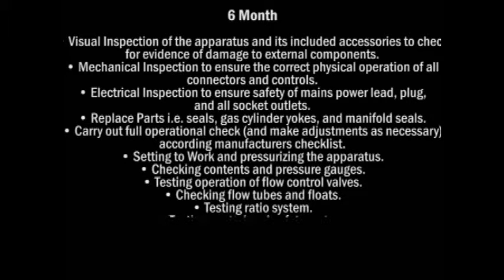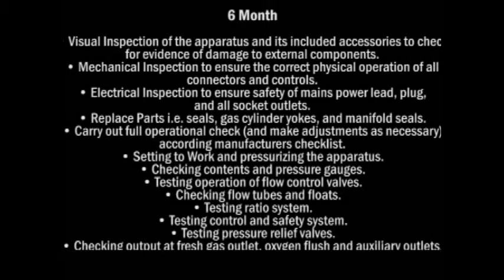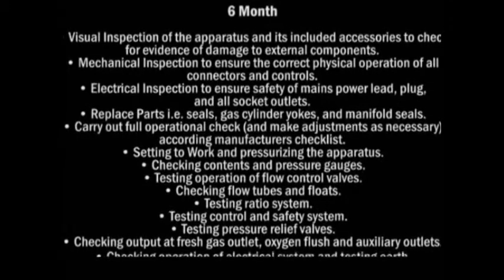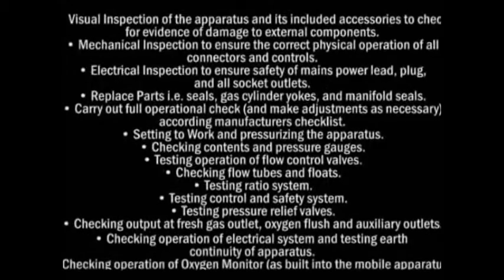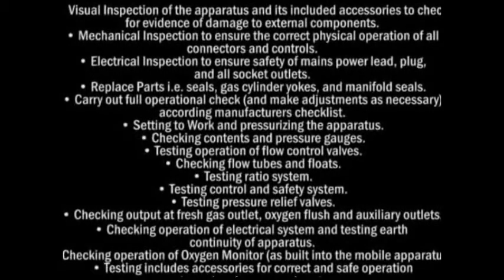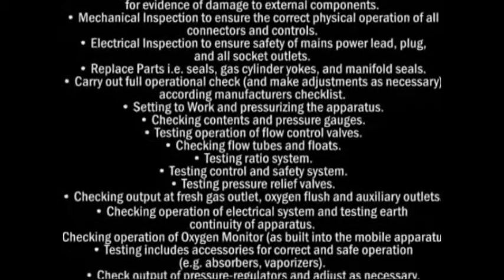Checking flow tubes and floats. Testing ratio system. Testing control and safety system. Testing pressure relief valves. Checking output at fresh gas outlet, oxygen flush, and auxiliary outlets. Checking operation of electrical system and testing earth continuity of apparatus. Checking operation of oxygen monitor as built into the mobile apparatus.